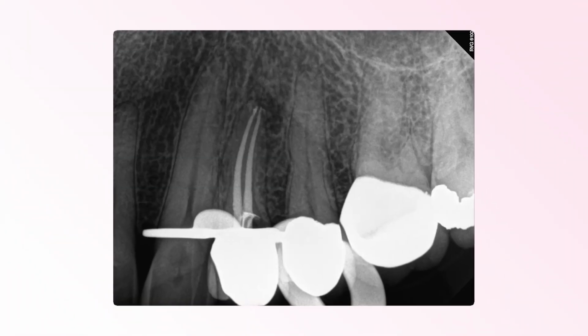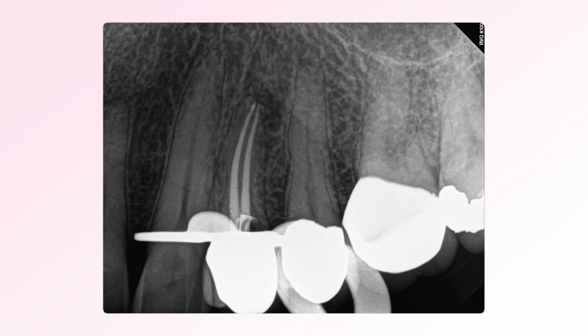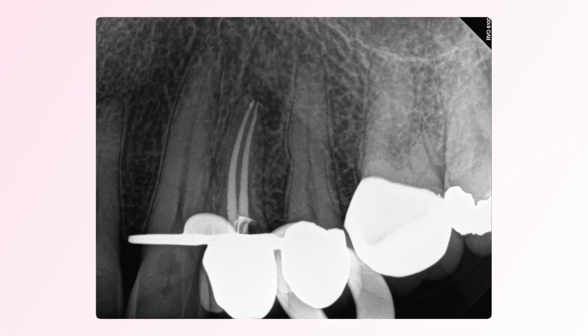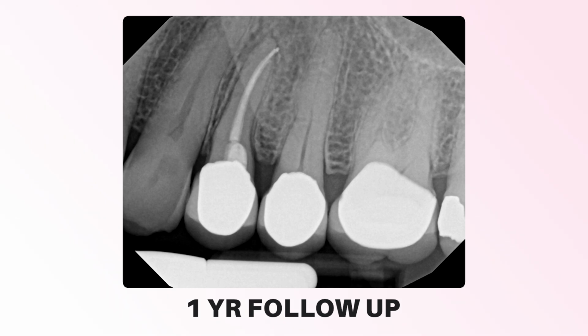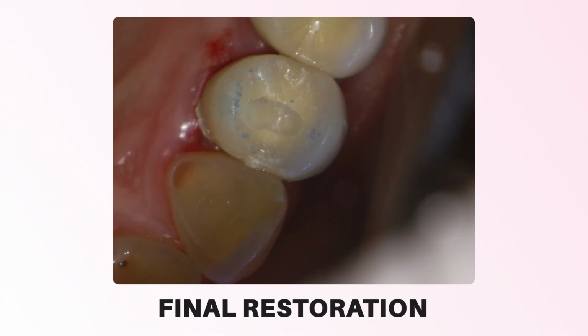Even still, in the bitewing, you can see that my access was drifting farther distally than I liked, and I dinged the canal wall, as we call it. The final access is larger than I would have liked, but at least I found the canals and completed the case without too much loss of dentin.